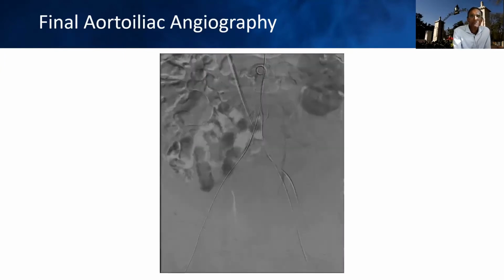I think we'll have to learn more as we go further along in our experience of whether we'll try to leave these iliacs in a way that we're treating them just enough to pass large bore sheaths, or, especially as we get into lower risk patients, whether we're going to want to treat them in a way that we maximize the patency and luminal gain for flow into the aortoiliac vessels.